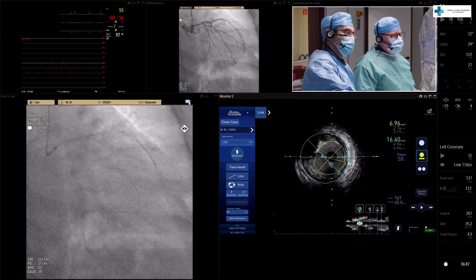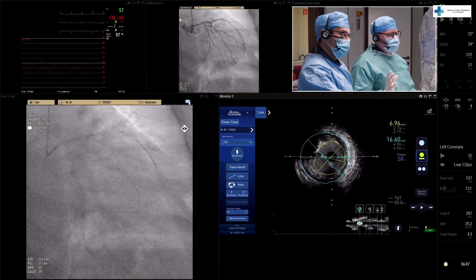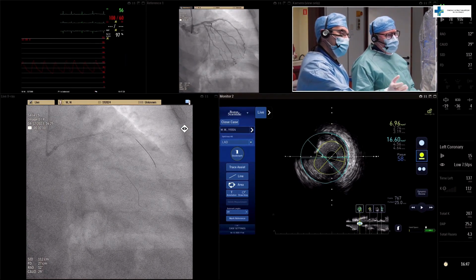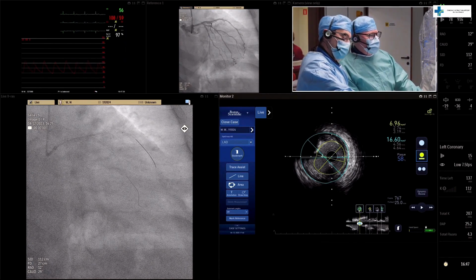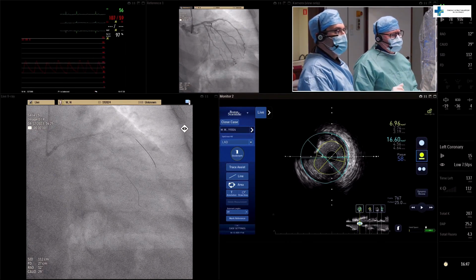As I said, you can see that the plaque burden in the proximal part of left main is still 60%. In the very proximal part it is less, but this is very close to the ostium. And this is the calcified plaque there. So I believe that the appropriate strategy is to cover the whole length with the stent. And the media to media diameter is more than 4.6 millimeters, so I believe that the balloon for POT can be 4.5.